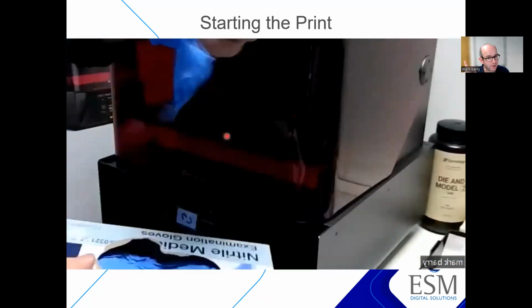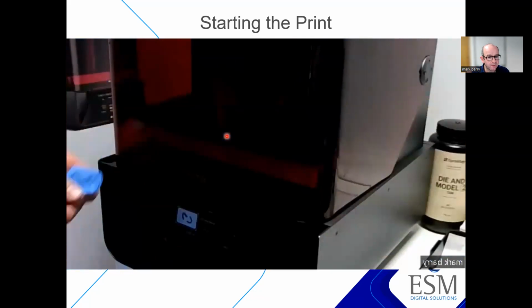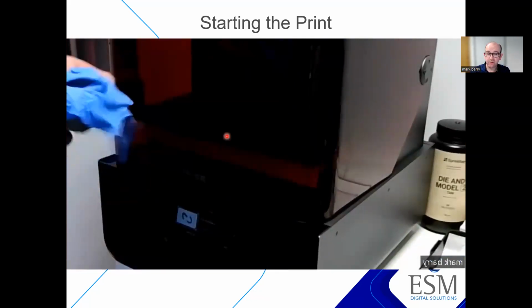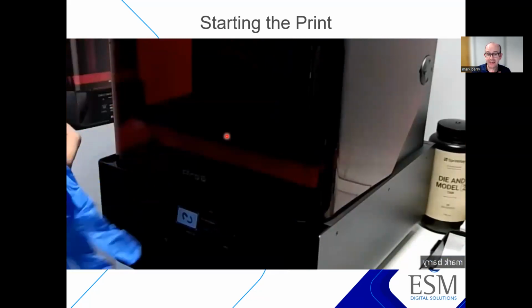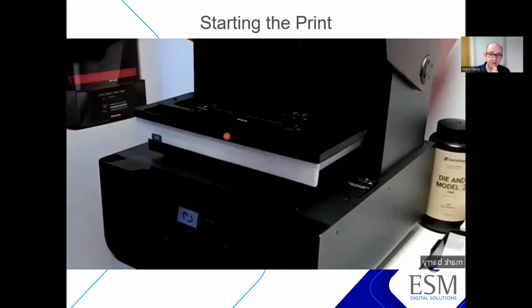We've seen the preparation of printing for Formlabs. Very similar with SprintRay. It's cloud-based, which is really interesting. You don't have to have a PC connected to the printer. We can label within it and lots of other bits and pieces as well.